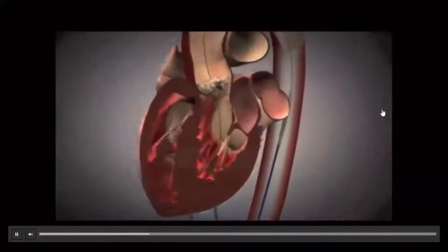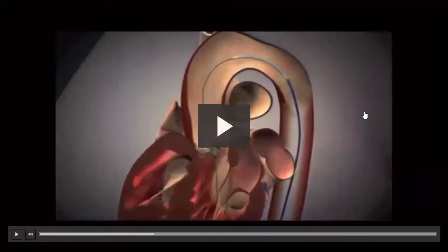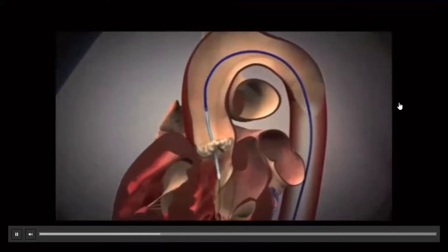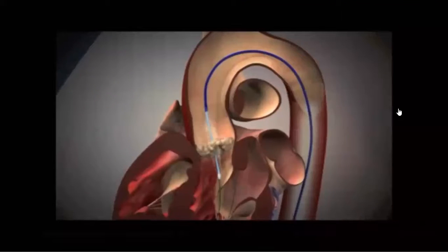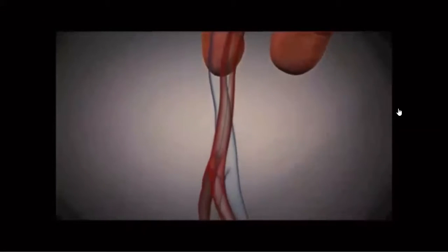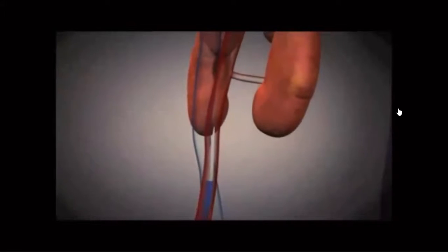Following that, a balloon catheter is passed over the wire into the stenotic aortic valve. The balloon catheter is then inflated, opening up the stenotic valve, cracking the plaque, and freeing up the leaflets. And that's in preparation for the stent valve, or the transcatheter valve, to be inserted.